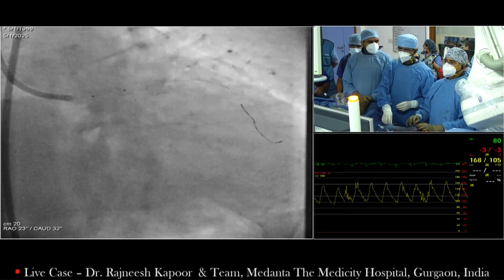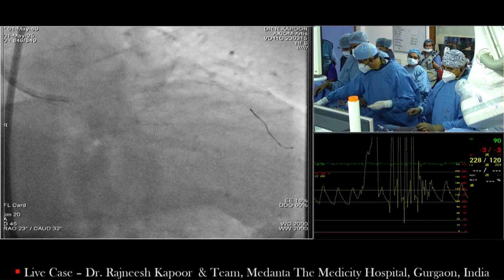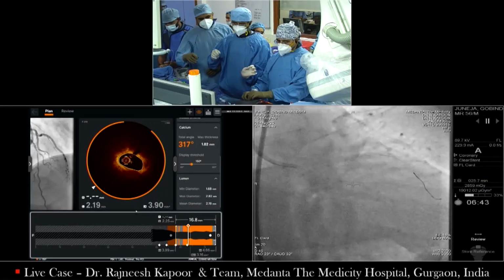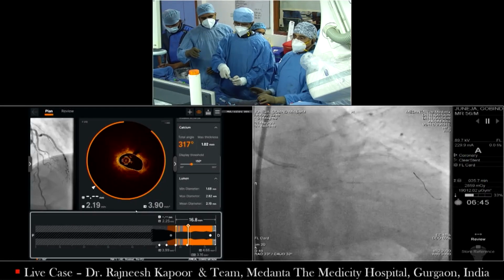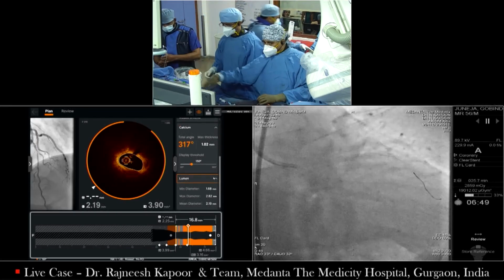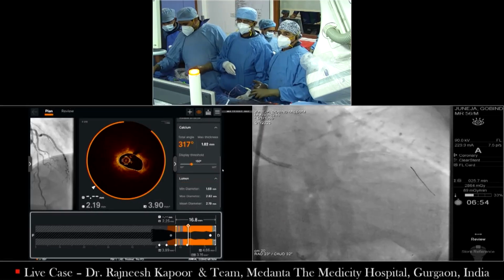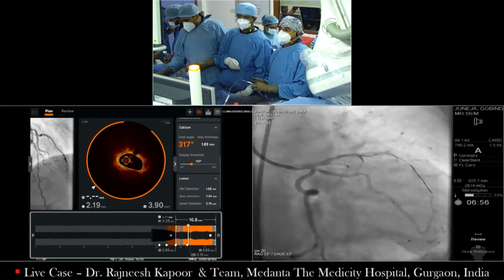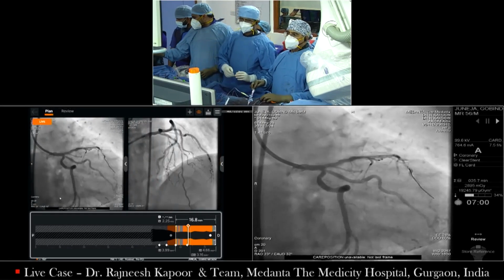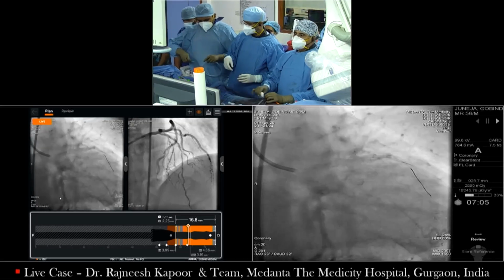There is dissection extending into the left main. Okay, give me a 3 balloon. We'll show you an OCT image just now. One more dilatation. I'm stepping up the balloon size so that we prepare the vessel bed well. Give me 3 and keep the OCT ready after this.